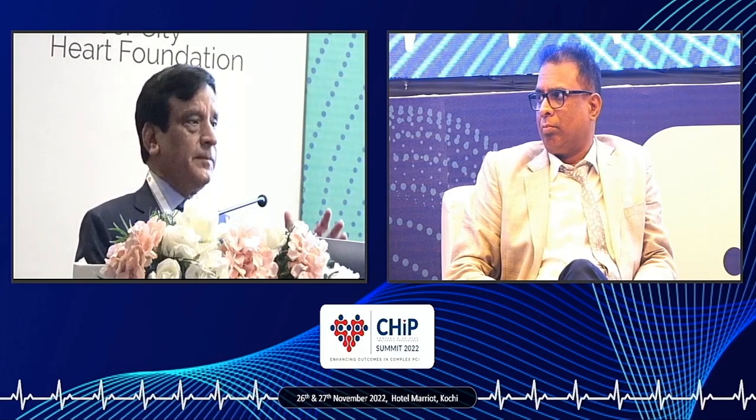So I would say this is a very good thought, just like having a device synergy and deciding where to limit ourselves, because we also learn multiple long stents can give trouble and have a high restenosis. So can we shorten the stent length, and use a drug-coated balloon for some? Good concept. I don't have experience, and there's not much in the literature either in these complex cases.